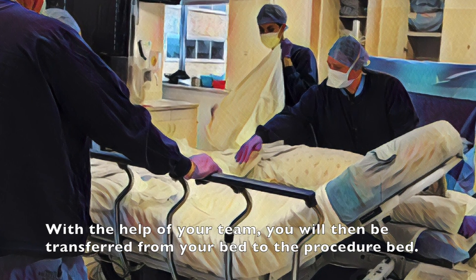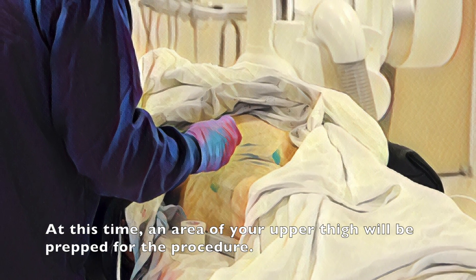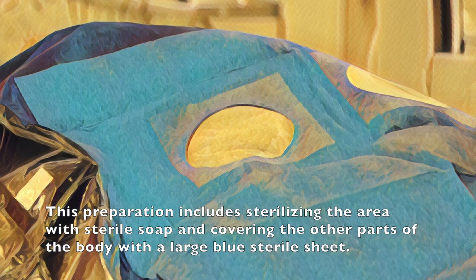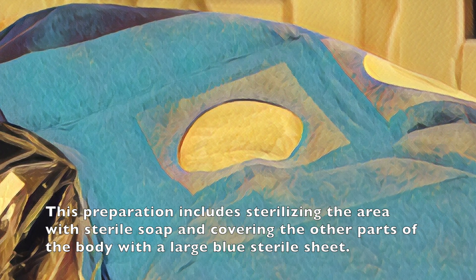With the help of your team you will then be transferred from your bed to the procedure bed. At this time an area of your upper thigh will be prepped for the procedure. This preparation includes sterilizing the area with sterile soap and covering the other parts of the body with the large blue sterile sheet.